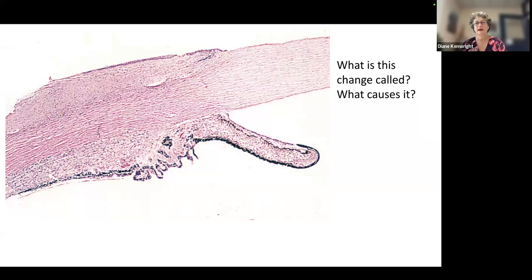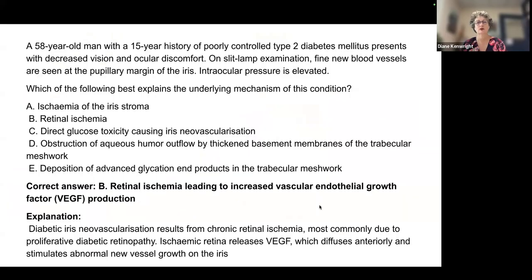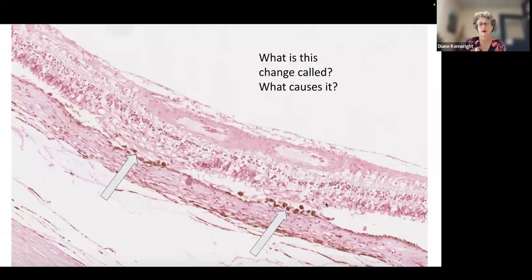Other things you might see in diabetic eyes are retinal burns. When retinal laser therapy is used, it causes these little micro burns to the retina. It adheres the retina to the RPE by gliosis. You can see some RPE proliferation here. There's loss of the outer nuclear layer and the photoreceptors here, but because it's peripheral, people don't usually notice it in their vision. The idea is to tack down the retina so that the neovascular membrane we see here does not pull it off, and the person doesn't lose all their vision immediately. Then there's the final MCQ, and that's the end of that slide set. Thank you.